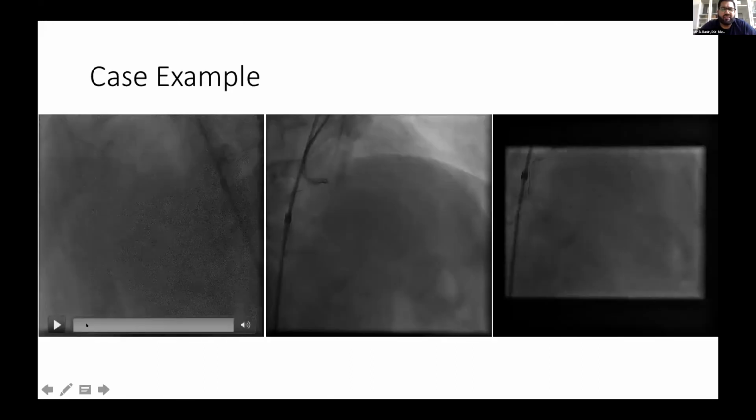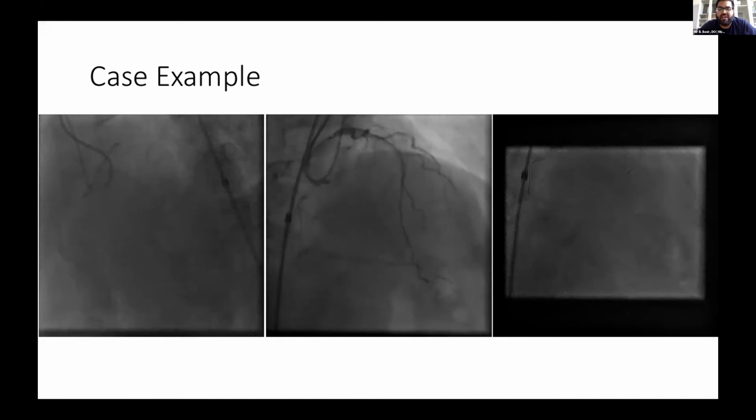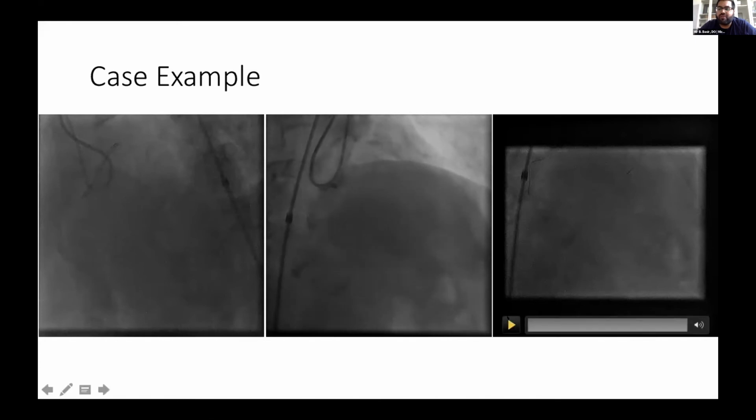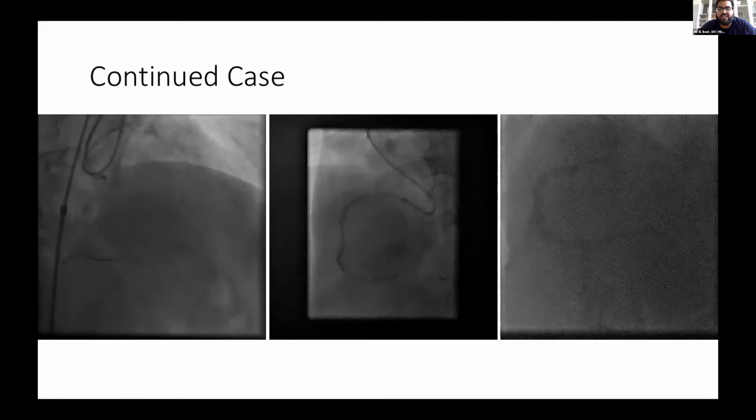So let me give you an example of a case. This is a heavily calcified obese patient. I know that it doesn't look so good on your screens, but it doesn't look so good on my screens either. It's a really obese patient. You can see here, originally tried antegrade, but it was too long of a lesion, too heavily calcified, and so ultimately ended up going retrograde. And you can see, pretty simple connection here. So we wired across with a Gaia, and ultimately my retrograde catheter here was a Caravel. So really, I'm just going to be able to give a lot of pushability.